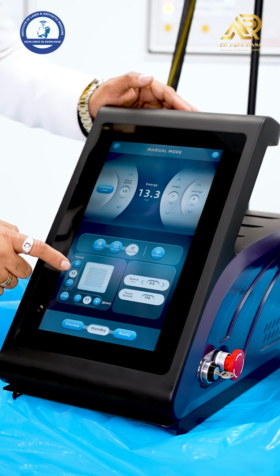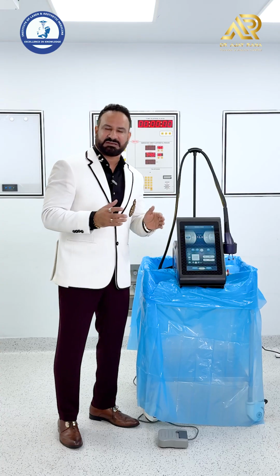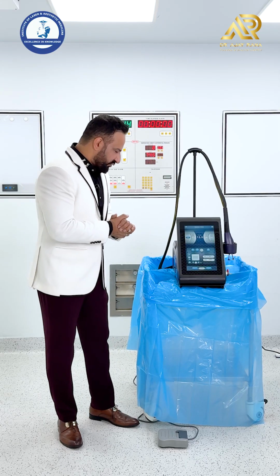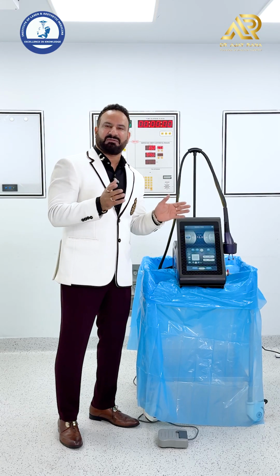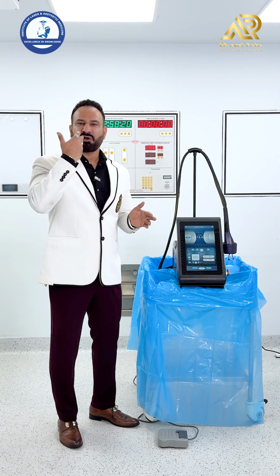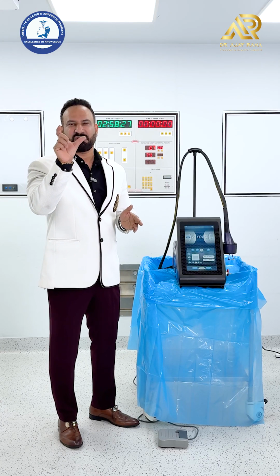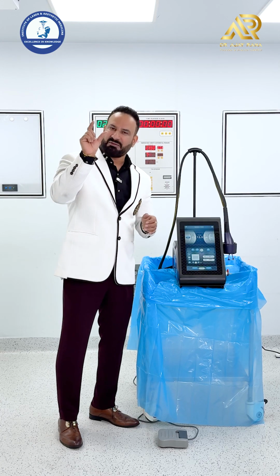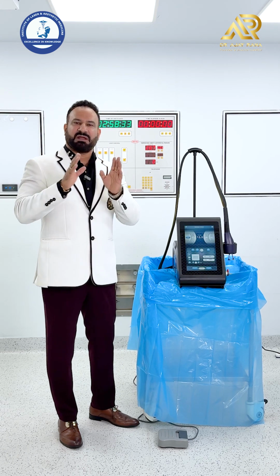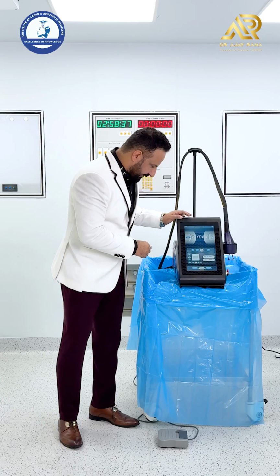The pattern, basically you can change the x-axis and y-axis. So you can have a rectangle, a linear line, a square, and so on. Depending on the treatment area, let's say you are doing the upper lip, a cleft surgery scar on the upper lip, you want to have a rectangle instead of a square. So you can have a bigger square, a smaller square, a bigger rectangle, a smaller rectangle, a linear line, and so on.